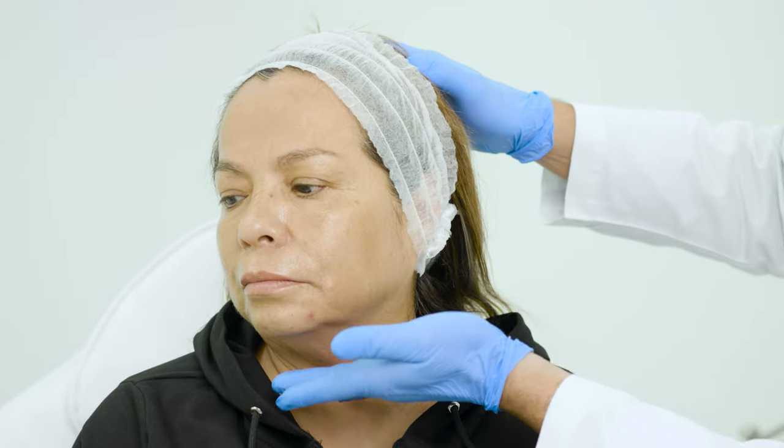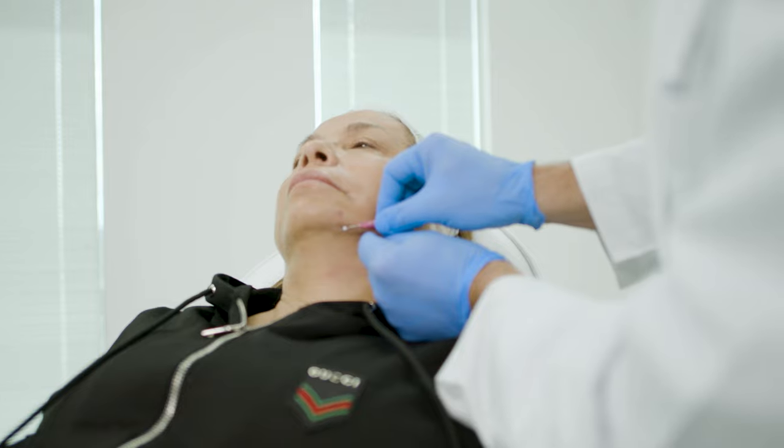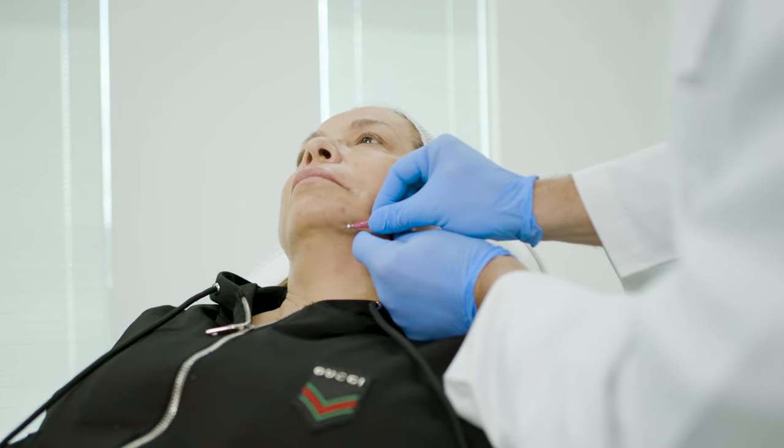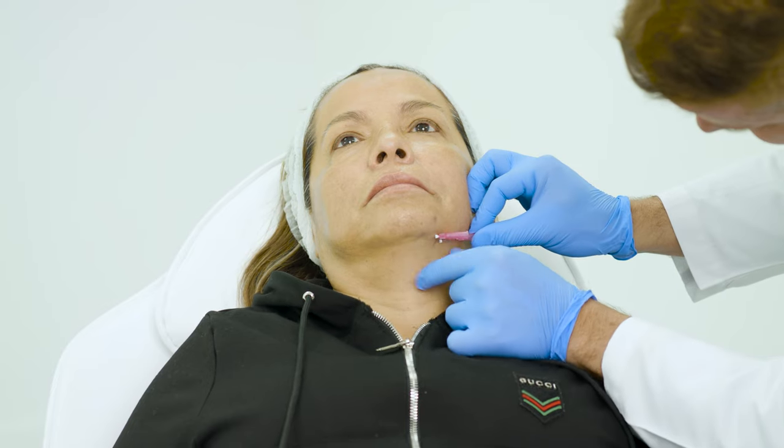Today we're going to demonstrate the basket weave pattern, which is one of my favorites — one of our quickest treatments with very low risk of side effects. For these monofilament threads, they're just going to go in the subdermal plane. There are some vessels here, so there's a slight risk of bruising. We'll just avoid any that we can visibly see, and if we happen to get a little bleeding, we'll hold pressure if that occurs.